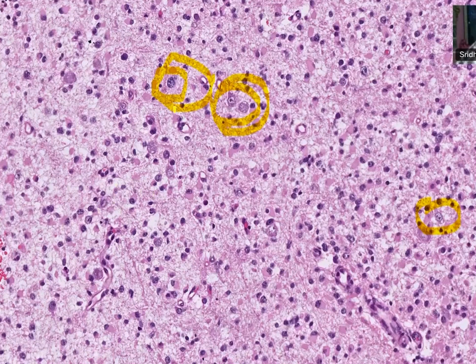You can say that this nucleus is pleomorphic, larger than other cells, varying in size. So definitely pleomorphism is there, right? What else do you want to describe in a diffuse glioma histologically? You saw the cellularity, it is cellular. You said nuclear pleomorphism. What else? So vascular proliferation. Right after the anaplasia, you go to the vascular proliferation. Background, you have already told, fibrillary matrix.